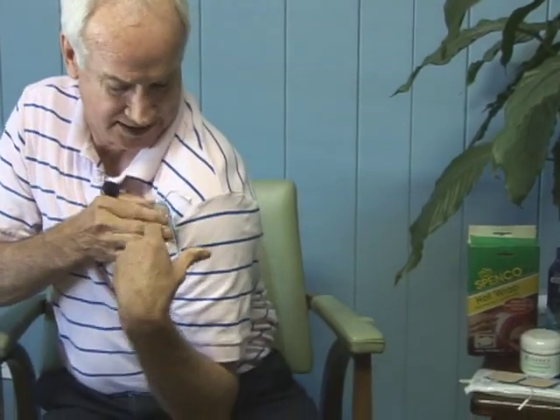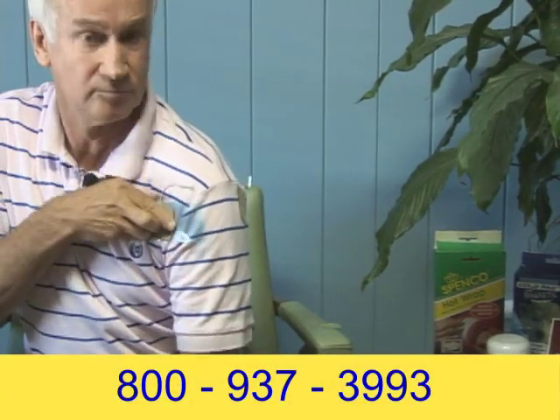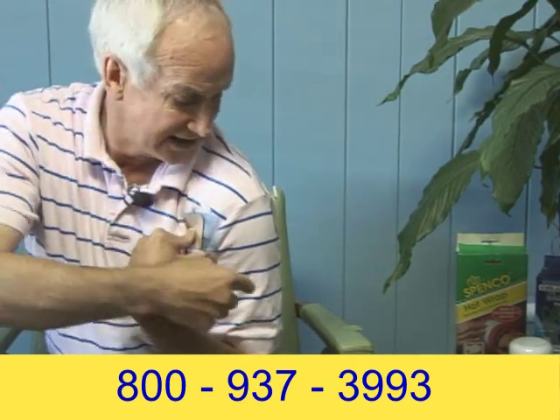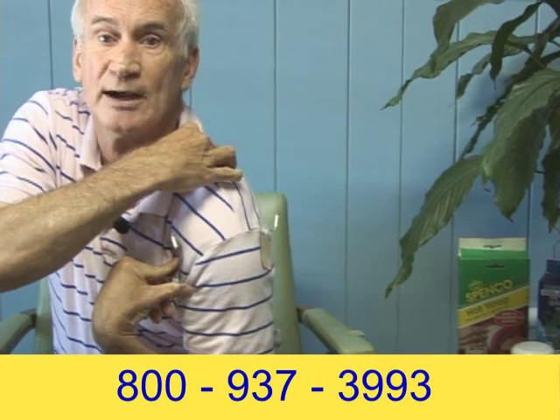If the pain is coming here in my shoulder, I may take one electrode and put it here, then take the other electrode and put it on the opposite side. So I'd have one here, electricity comes on, goes across — and my pain is right in there in the joint area. Then I'll take another electrode, put it here, and put another one right up here.